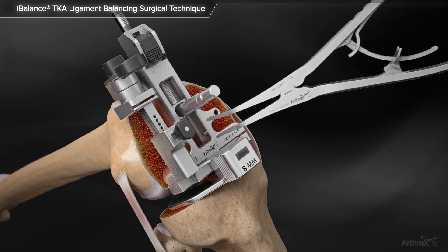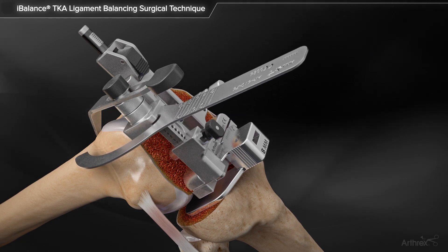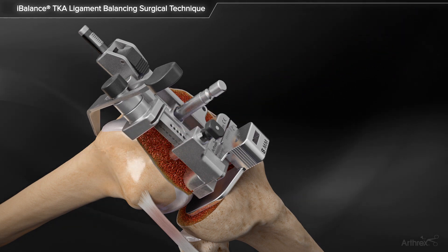Note the femoral sizing readout on the stylus. The angel wing is then used to assess the anterior femoral resection depth and ensure the femur will not be notched.